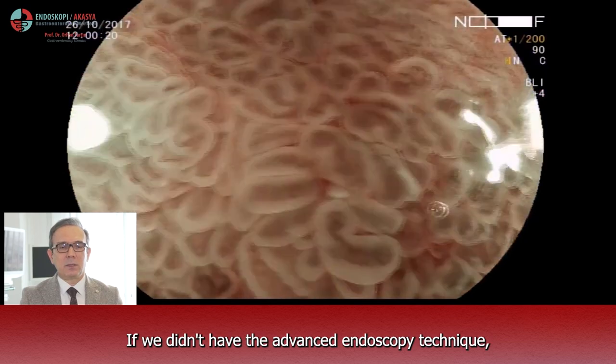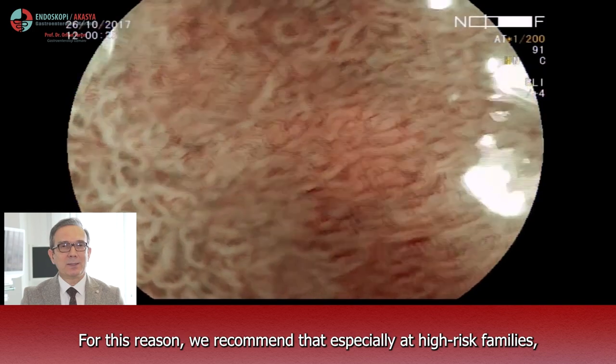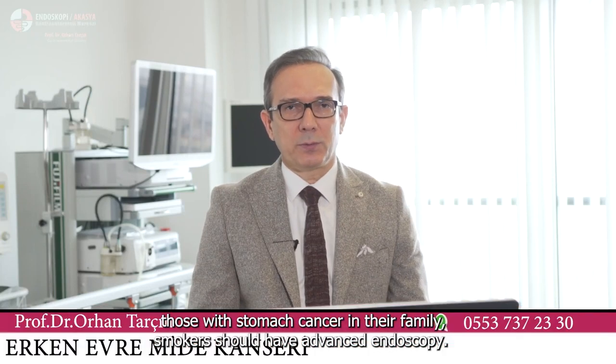If we didn't have this advanced endoscopic technique, this would easily go unnoticed. For this reason, we recommend that especially at high-risk families — those with stomach cancer in their family — and smokers should have advanced endoscopy.